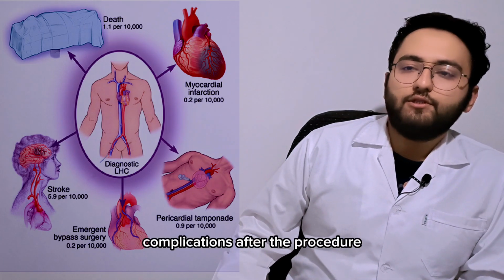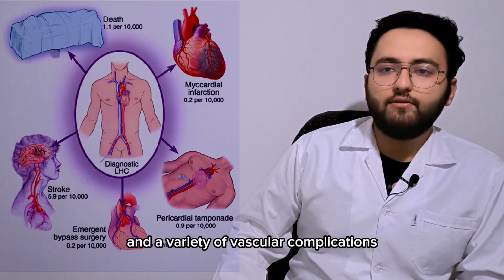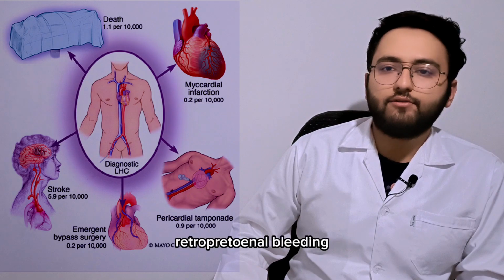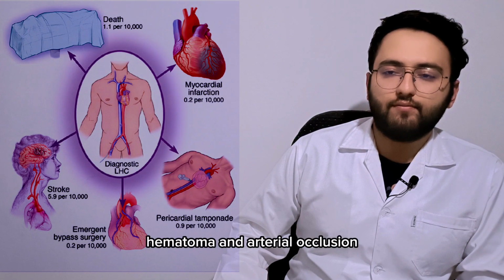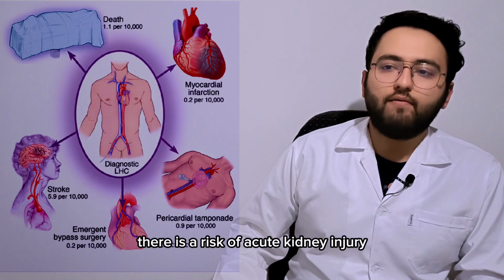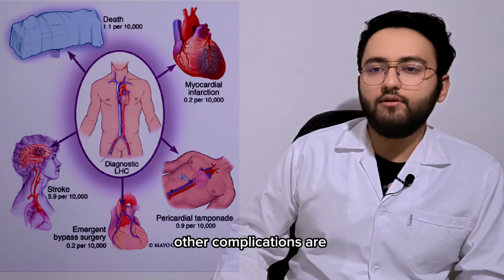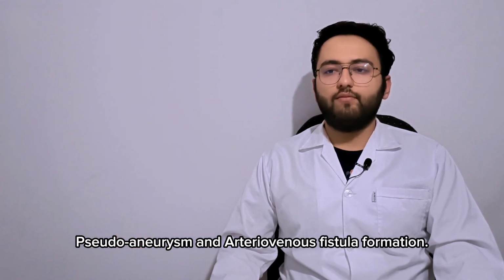Complications after the procedure may include abrupt closure of the coronary artery and a variety of vascular complications, such as bleeding at the insertion site, retroperitoneal bleeding, hematoma, and arterial occlusion. In addition, there is a risk of acute kidney injury from the contrast agent used during this procedure. Other complications are pseudoaneurysm and arteriovenous fistula formation.